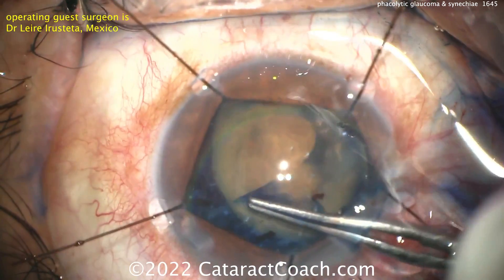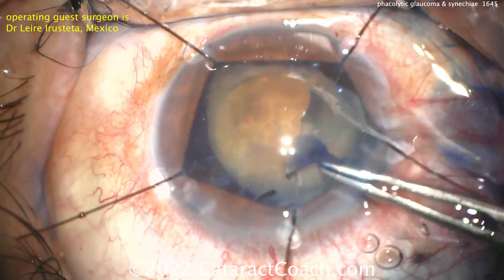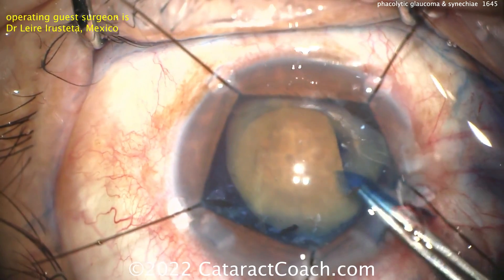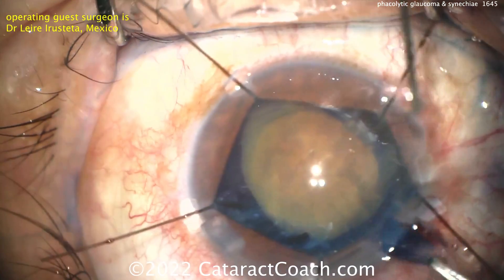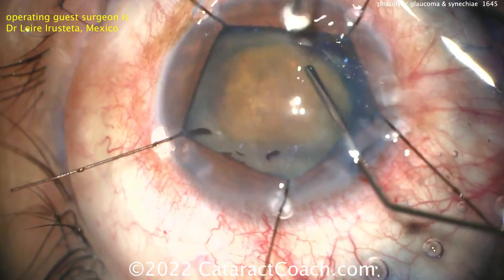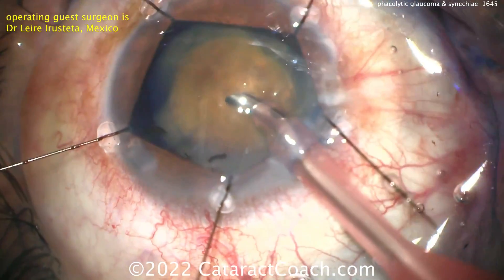Important to get a good rhexis here. Notice how the rhexis is centered over the lens capsule, where it should be — that's beautiful. The rhexis is not centered over the nucleus, which has shifted because of loss of the cortex and the epinuclear part. Now you can see how mobile that nucleus is, because the capsule bag is partially empty from loss of the liquefied lens cortex.